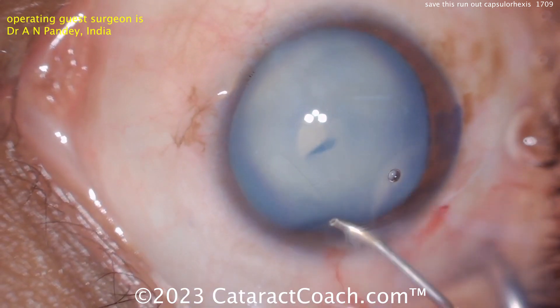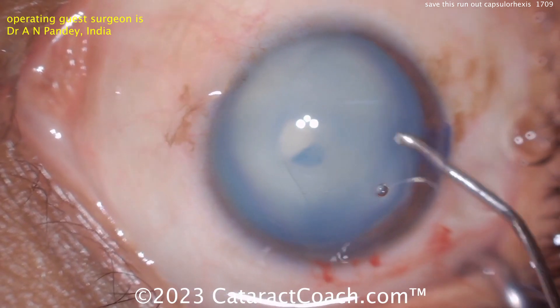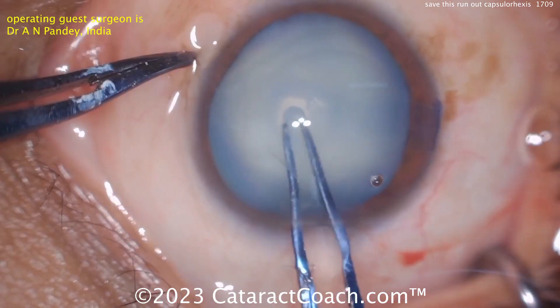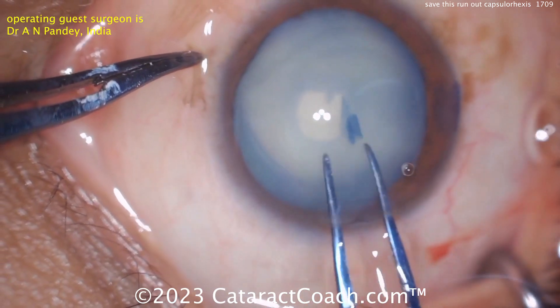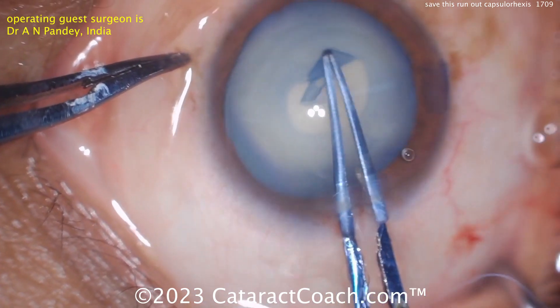Once that baby capsulorexis is done, you can really decompress the capsular bag, get all the liquefied lens material out, and then you can enlarge it and make your big rexis. So again, grabbing that there and completing the first baby rexis.